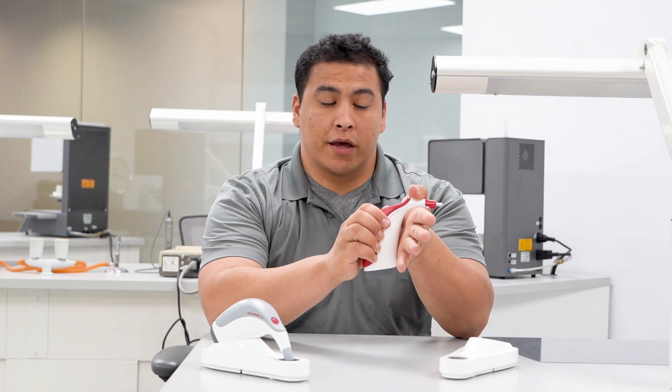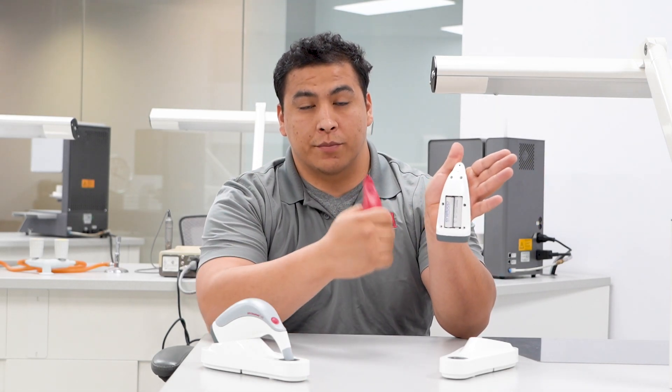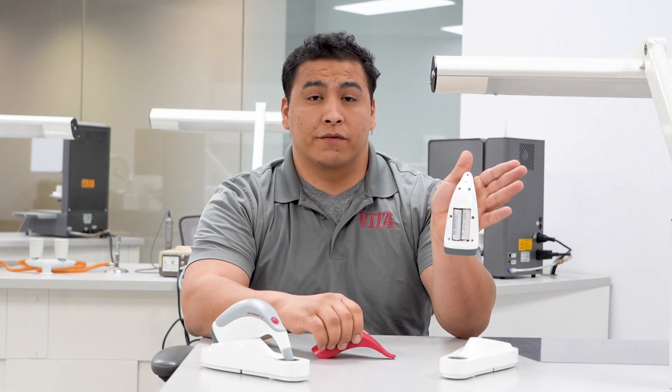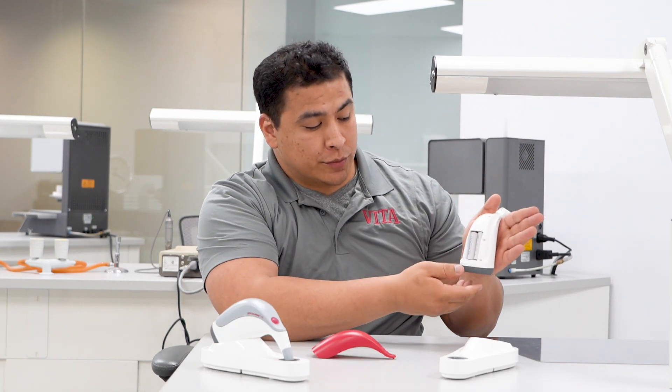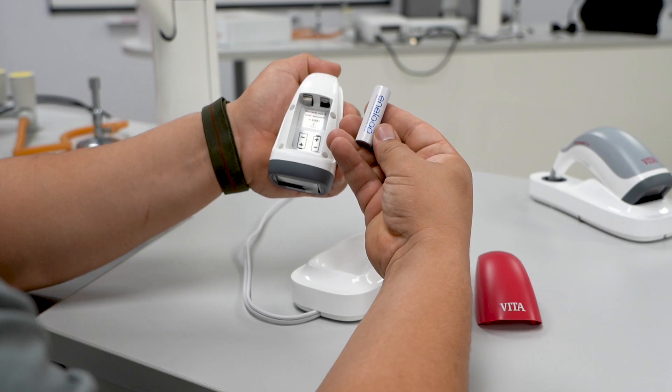To access the batteries, go ahead and give a firm pull straight back and you'll have access to the batteries. The Vita EasyShade 5 batteries are rechargeable — specifically rechargeable Eneloop batteries. These batteries are the only ones approved for use in the Vita EasyShade 5.